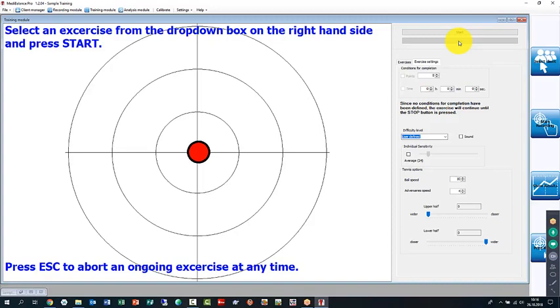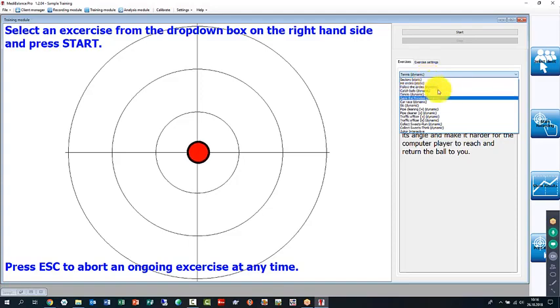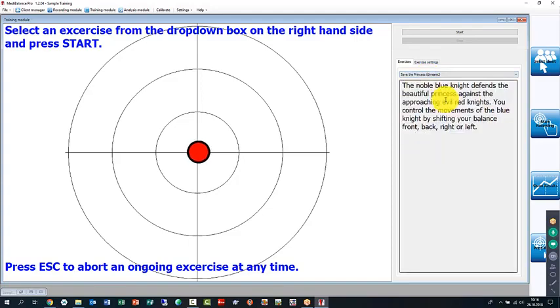So what the patient forgets about, the people that train with it, is, oh, they could fall, but they are so focused on the game that they come back to automating their routine of balance and shifting posture. Now the next one, we weren't sure how it would appeal to people. We find it that particularly older people do like it quite much.